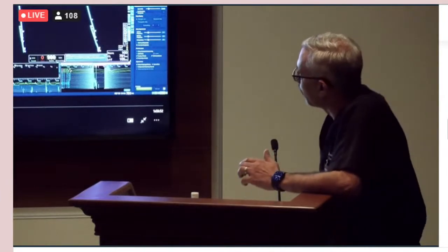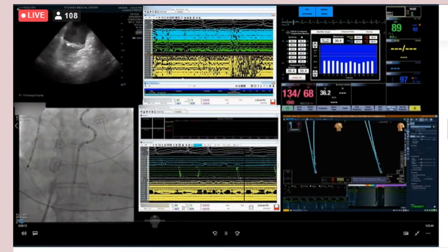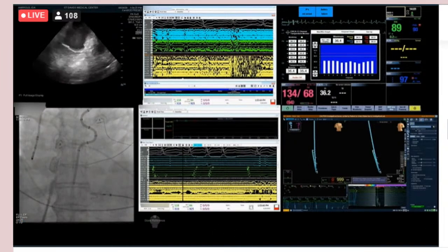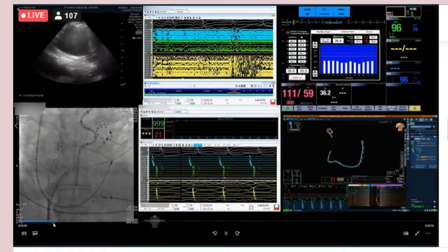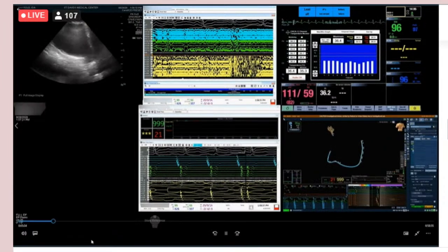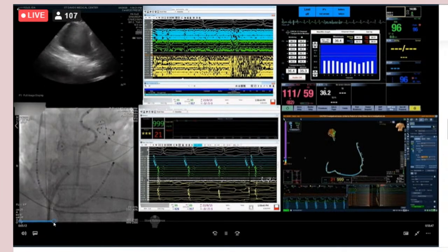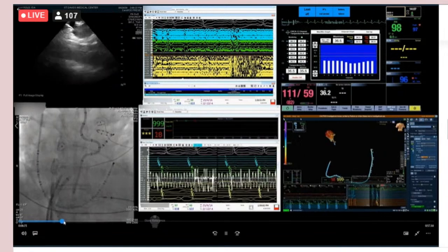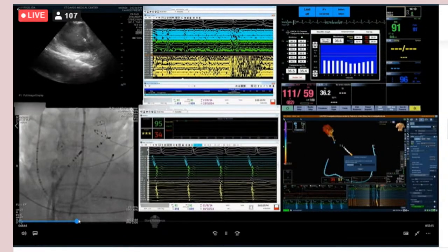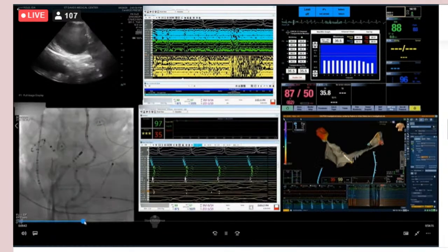And I think, Matt, I'm going to have you scroll through it because you probably are more familiar with this than I am. So this was actually part of the clinical study with Tactiflex, and maybe fast forward to after we're transeptal. So the advantage of this is you sort of take two catheter platforms that are both pretty good. Tacticath happens to have a really nice force contact sensor, and the Flex catheter gives less fluid and handles, in my view, a little bit better. So having the two together kind of adds a little bit of advantage. So here's the catheter in its transeptal, and let's go ahead and build the map, Matt, and go from there.